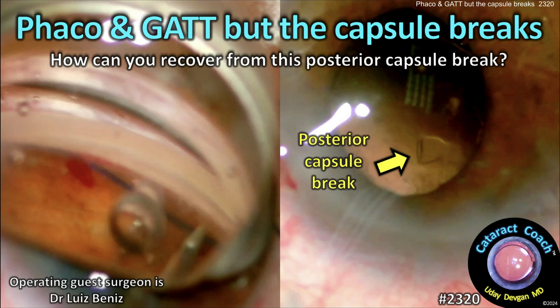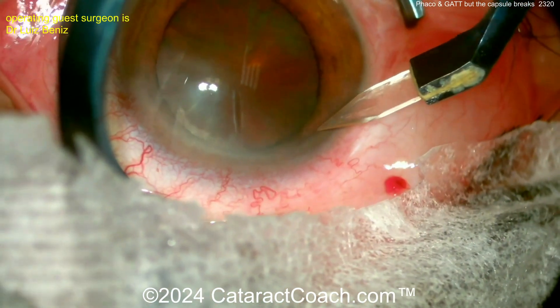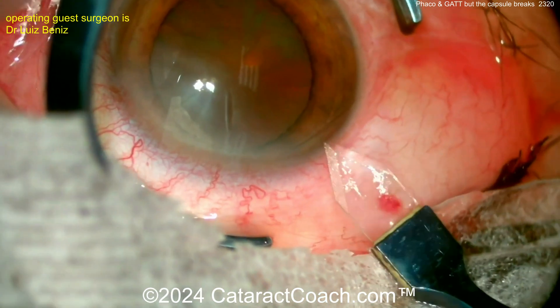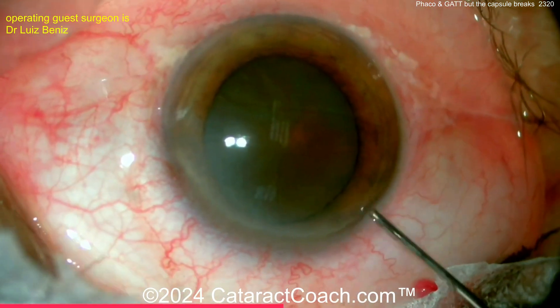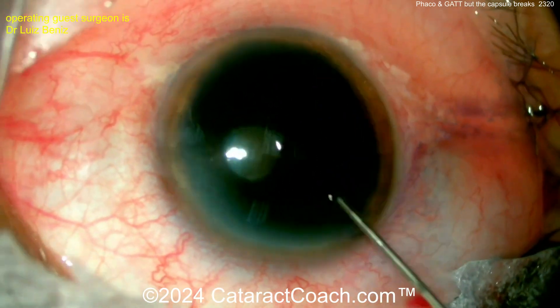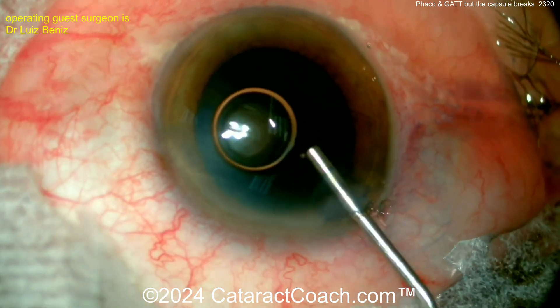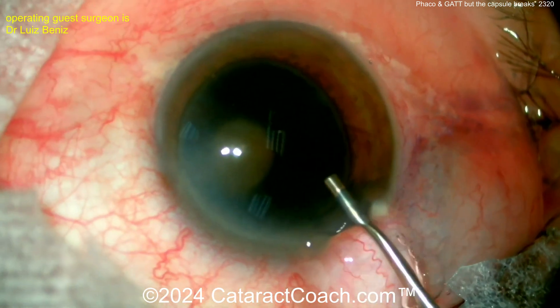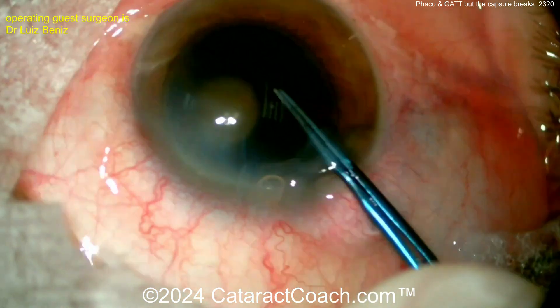Welcome to cataractcoach.com. Today we're looking at a case combining Faco and GATT, but the capsule breaks. How can you recover from this posterior capsule break? The patient has a cataract — look how opaque that lens is — and on top of that, the patient has glaucoma too. So you need to do something to control the IOP, the intraocular pressure. The surgeon will do cataract surgery, which alone will help lower the intraocular pressure, but maybe a little something else. The surgeon wants to do GATT — G-A-T-T — gonioscopy assisted transluminal trabeculotomy.